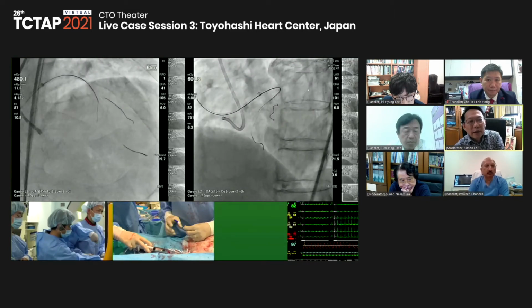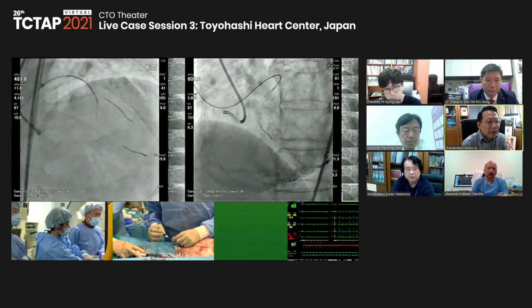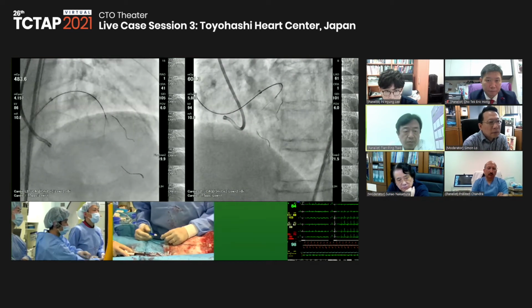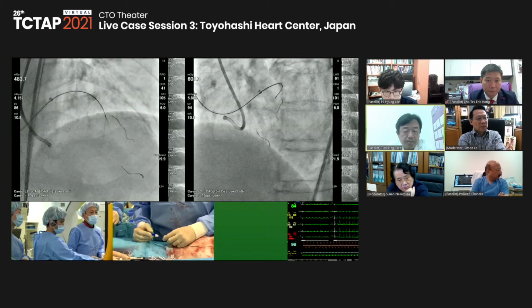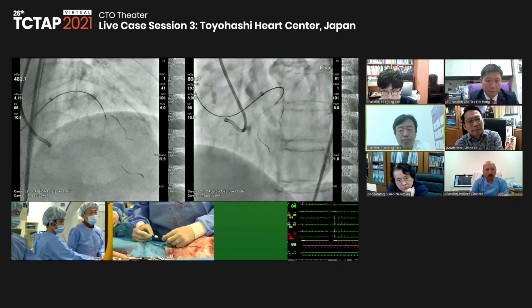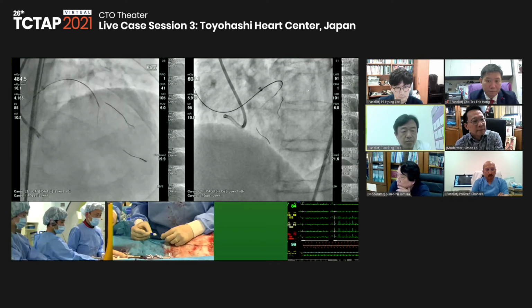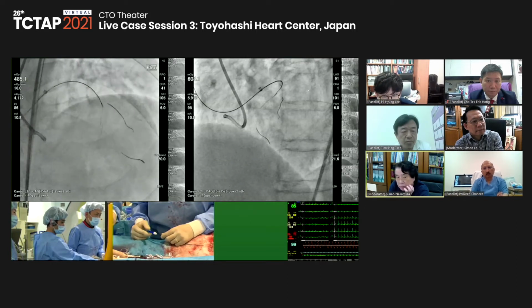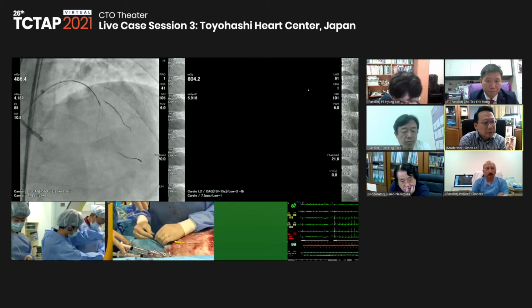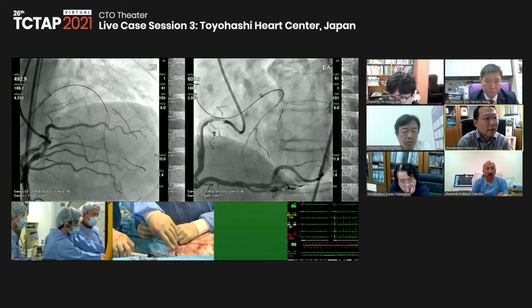No. The LAO view looks like it's good. But I have some resistance around here, on the AP cranial. One further. Okay. There we go. Yeah.